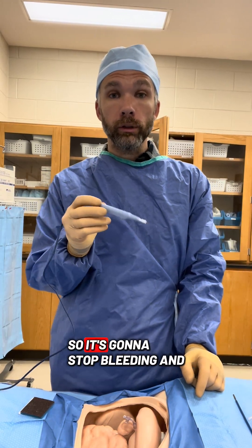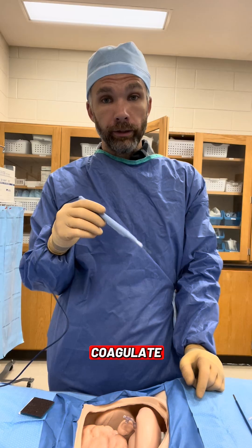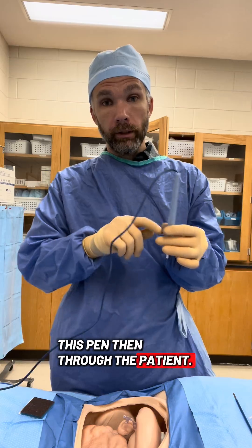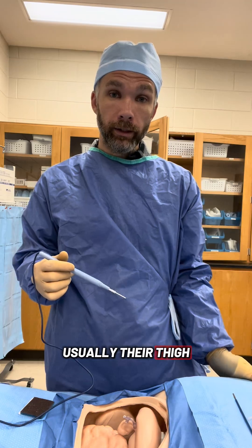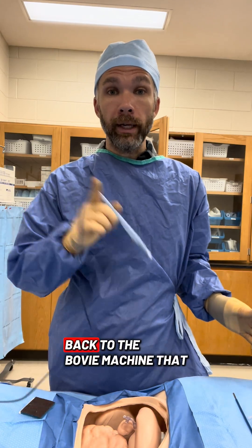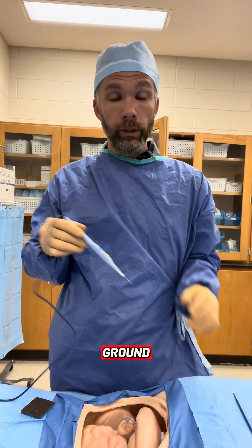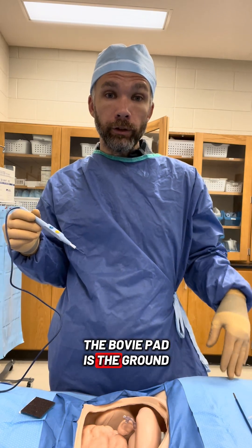Bovie is used for electric cautery — it's going to stop bleeding and coagulate. It runs with electricity, so this pen then through the patient. They have a Bovie pad on their thigh usually, and that Bovie pad runs back to the Bovie machine that this is plugged into, so it creates a complete circuit. The electricity is always trying to find the ground, and the Bovie pad is the ground.